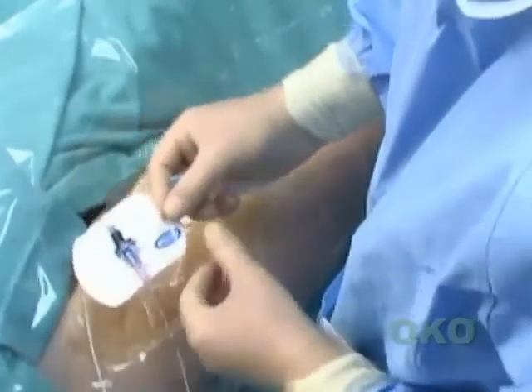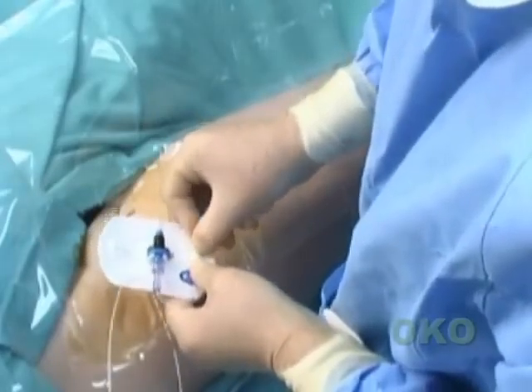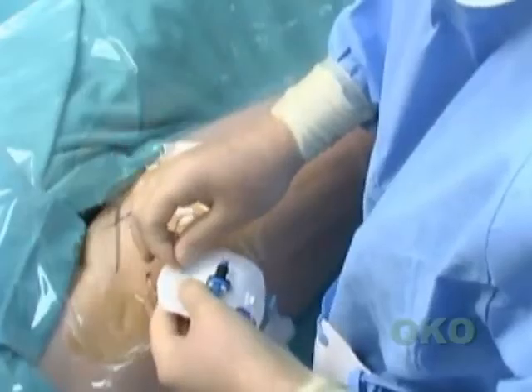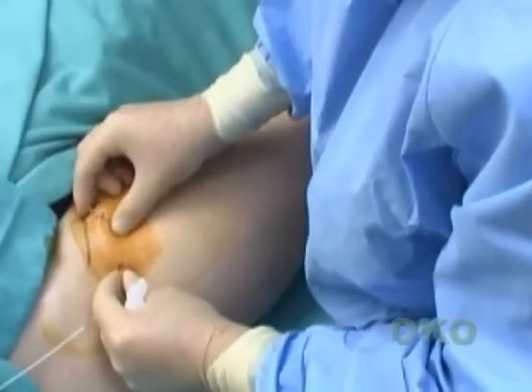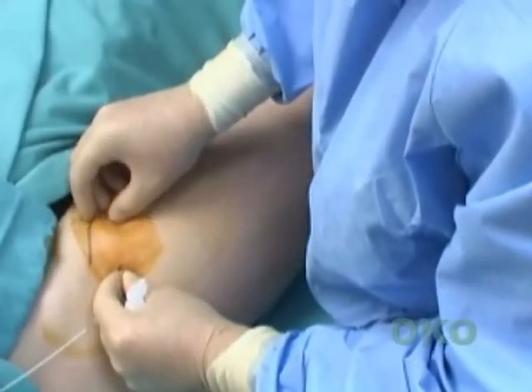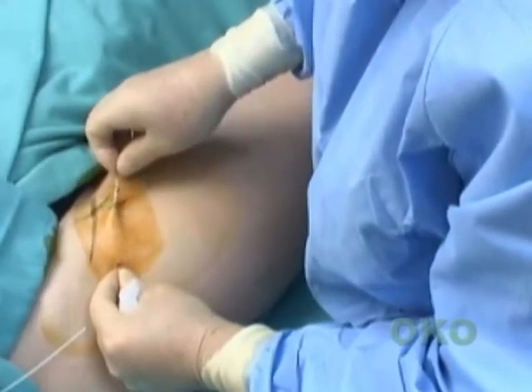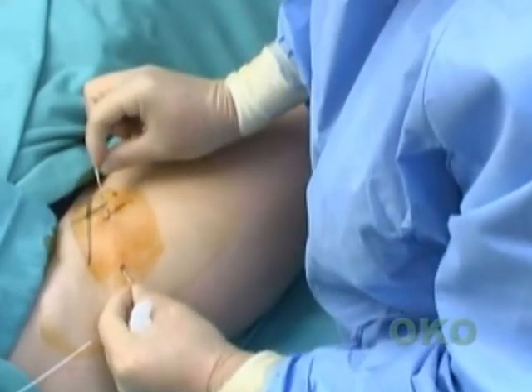The catheter and snap lock is placed in the stat lock, which is placed in a convenient position, usually on the patient's abdomen. Catheter removal is a sterile procedure and is done after the patient does not require the continuous nerve block any longer and after full sensation has returned to the leg. The proximal end of the catheter is fixated with the left hand, and the distal end is removed from the skin bridge. This part of the catheter is kept sterile, and the rest of the catheter is removed.